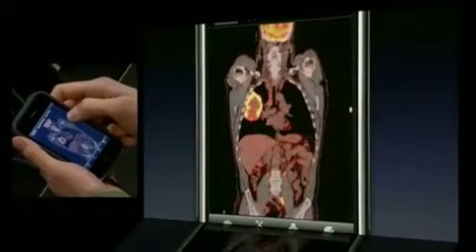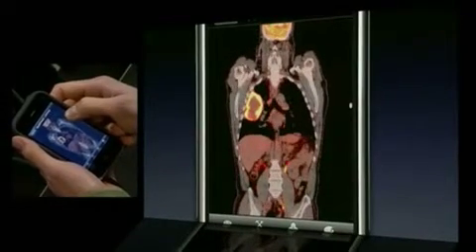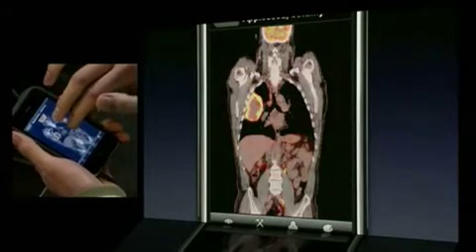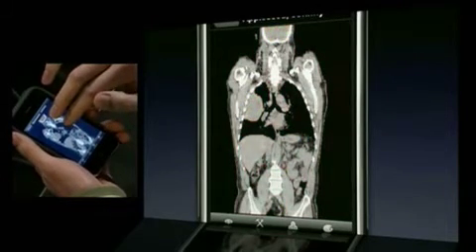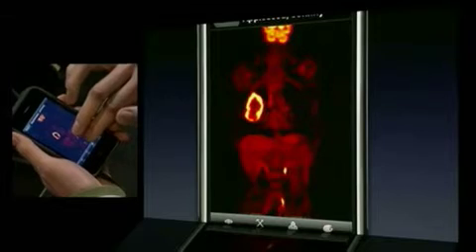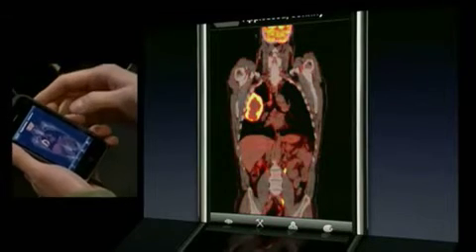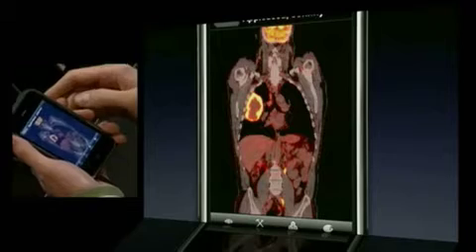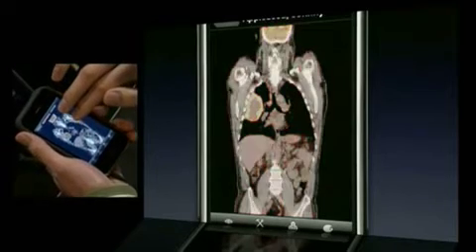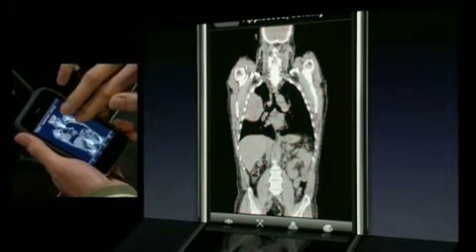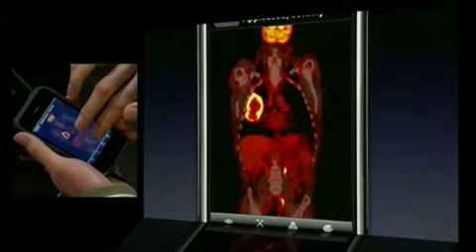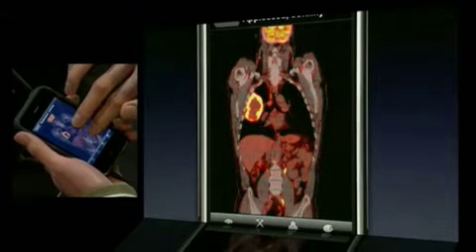Right now, we're moving through the slices of a fusion study with a one-finger slide, where we have a CT scan showing anatomic data and a PET scan showing metabolic activity. The two-finger slide changes the blending. Think of how a weather map works, where you have geographic data overlaid with temperature. We fuse the two together and present it as a multi-planar reconstruction.